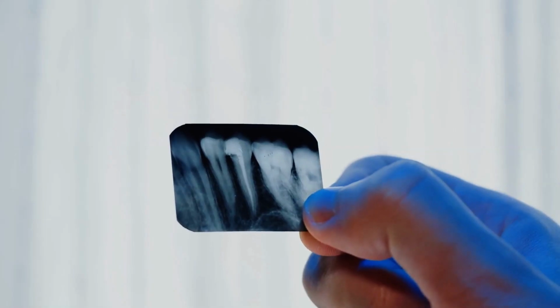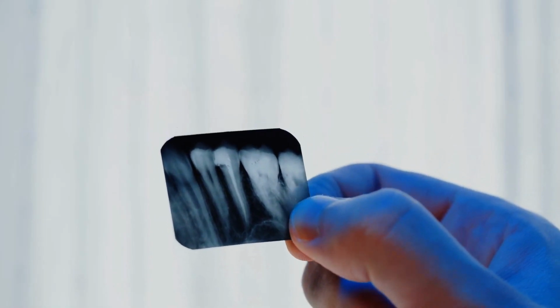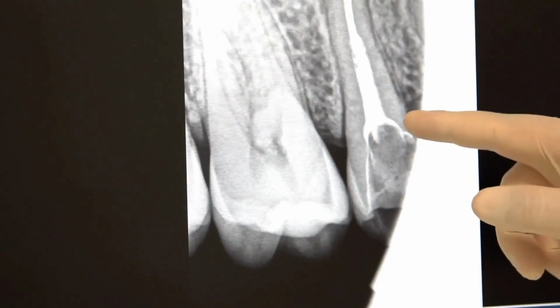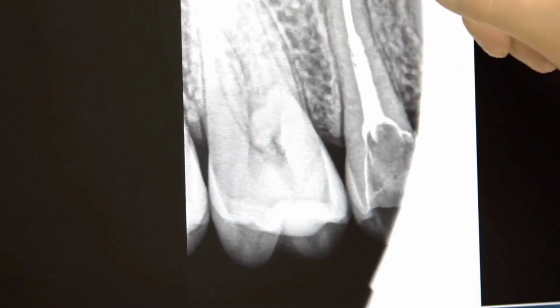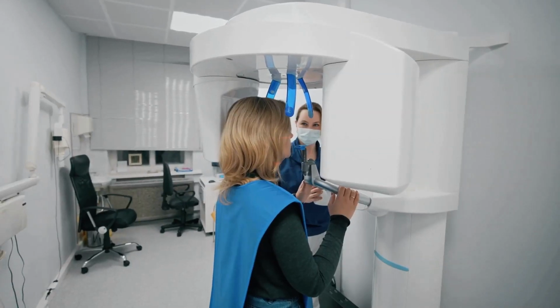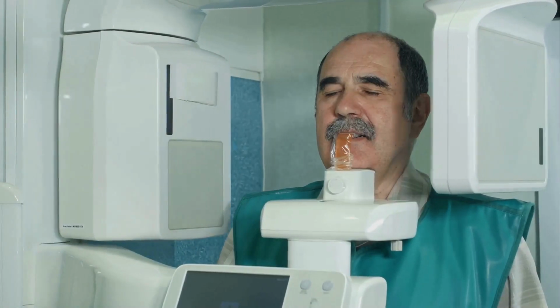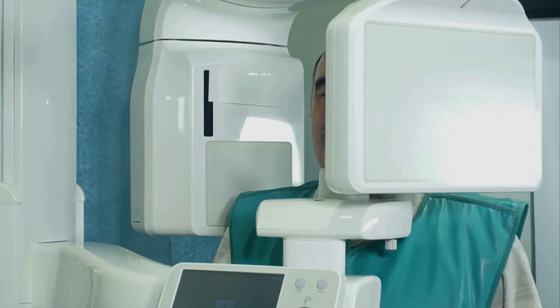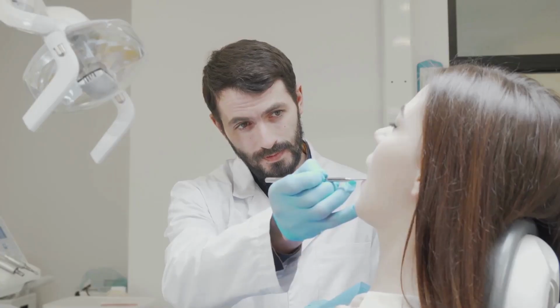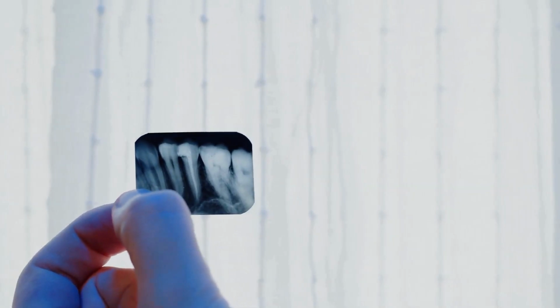Similarly, hairline fractures, which are tiny cracks in the enamel that can be difficult to spot with traditional methods, become readily apparent under cross-polarized light. The light, as it interacts with the crack, undergoes a change in polarization, creating a distinct pattern that highlights the fracture with remarkable clarity. This ability to visualize hairline fractures is crucial, not only for diagnosing the problem but also for determining the appropriate course of treatment, as the presence of cracks can significantly influence the longevity and success of dental restorations.